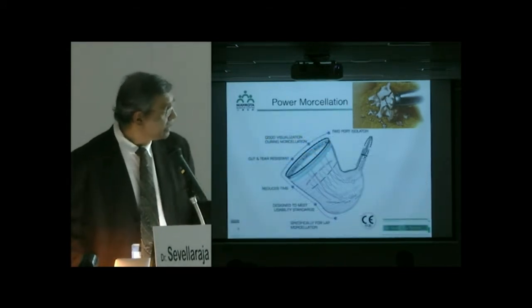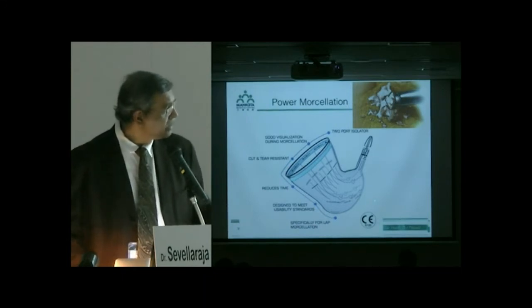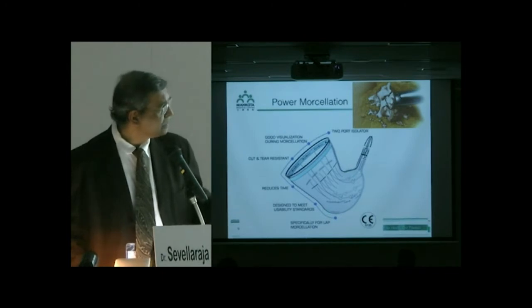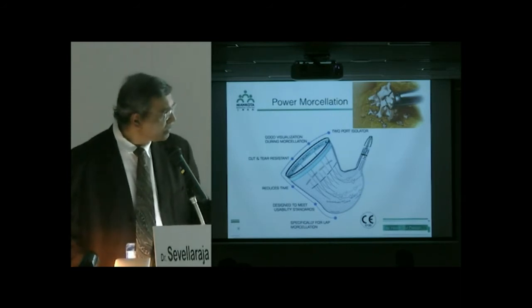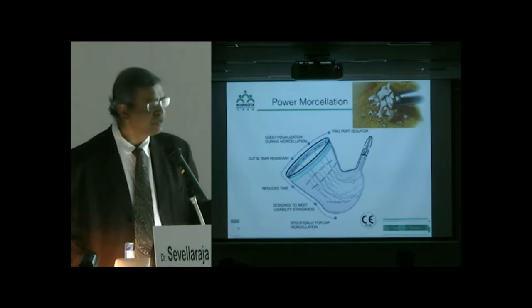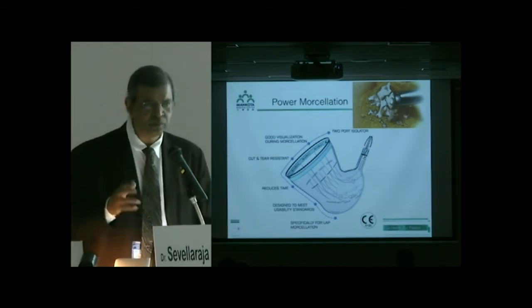This particular bag also comes with a disposable morcellator. The bag has a large opening that is quite thick, and a blue coat which is very useful when trying to put the specimen inside. Importantly, it is rounded — some bags are square — so tissues don't get trapped in corners. It also has a tail, which I'll explain shortly. The concept is to morcellate through this bag while viewing through the camera, but the disadvantage is you only have one instrument inside with no second or third instrument to hold the fibroid.